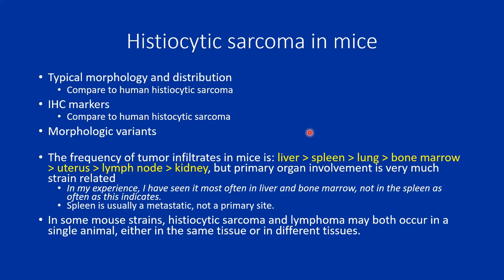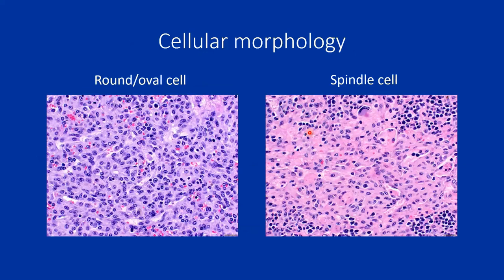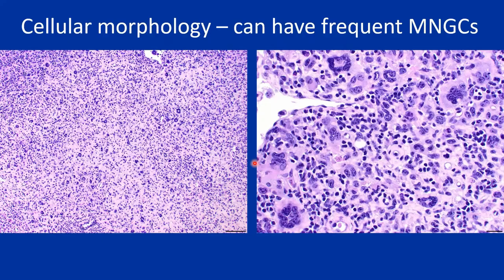You can get histiocytic sarcoma and lymphoma in the same animal. The morphology of the cells can vary widely, making the diagnosis hard. It can range from a typical round cell with more cytoplasm than lymphocytes, to being really spindle cell. I found a slide that really shows how it can have a lot of multinucleated giant cells — from a lymph node — and you can see them standing out on low power.